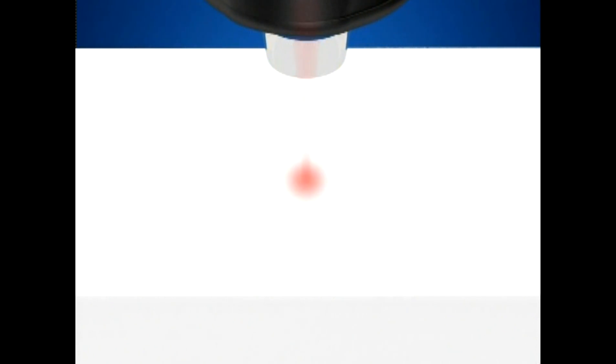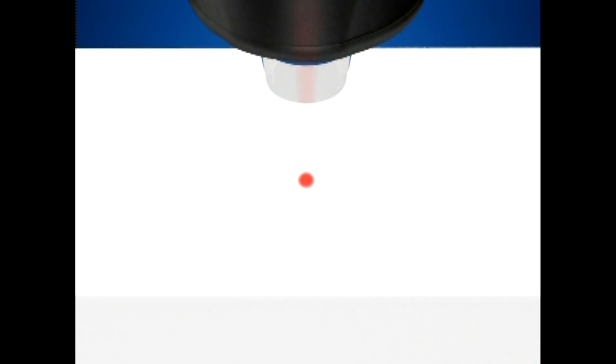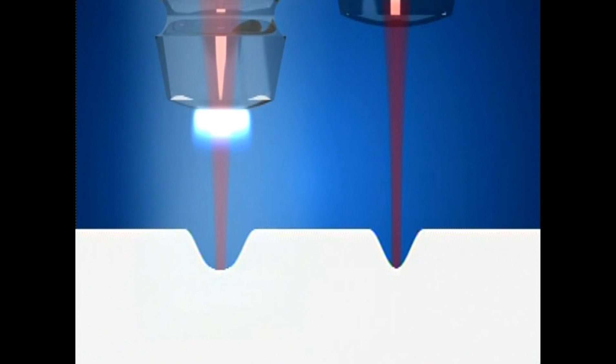Focusing and defocusing the laser beam will allow you to control the cutting speed without having to adjust power. To slow down, pull the hand piece away from the tissue surface. To increase cutting speed, bring the hand piece closer to the tissue surface.